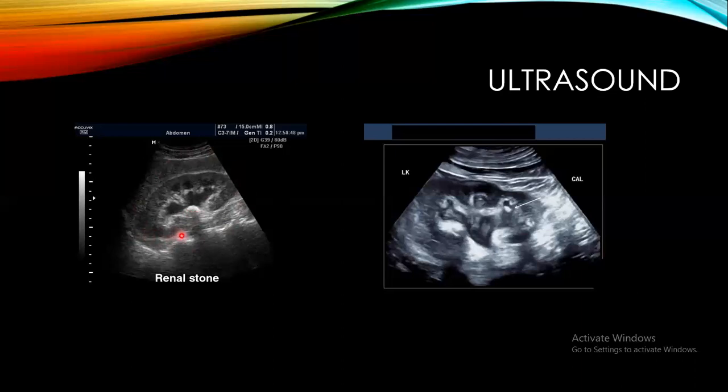picture. Also, I have to mention another thing: every echogenicity on your left hand, this is the upper pole, while any pathology or any area on your right hand, this is the lower pole of the kidney, and in between them this is the mid pole. يعني اتجاه السونار دائما يكون كل شيء على ايدك اليسار هو الأبر بول، كل شيء على ايدك اليمين هو اللور بول، وما بينهما هو الميد بول.